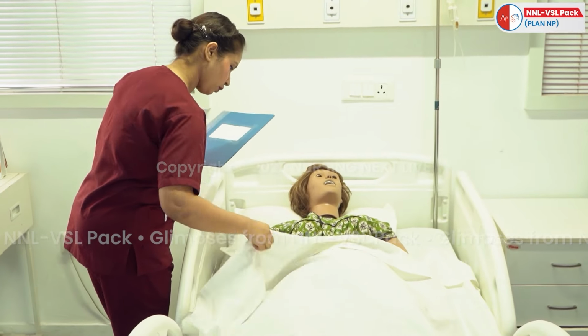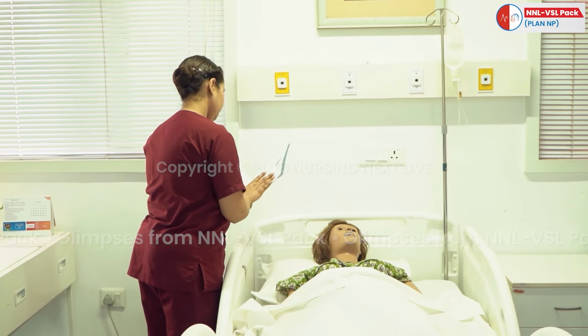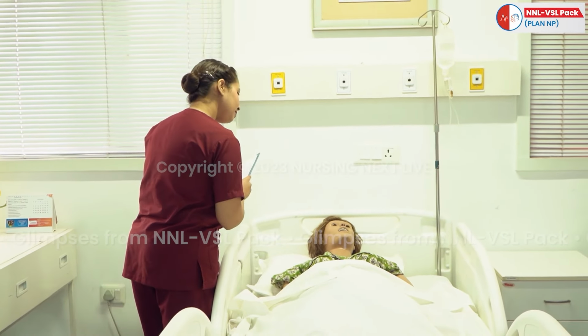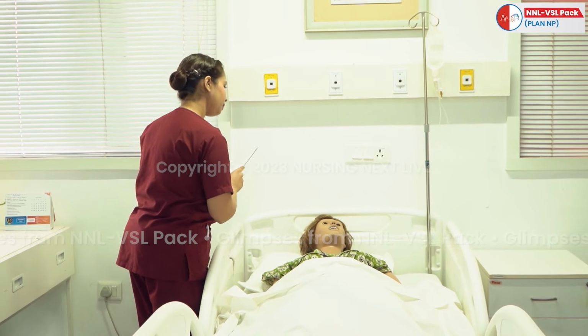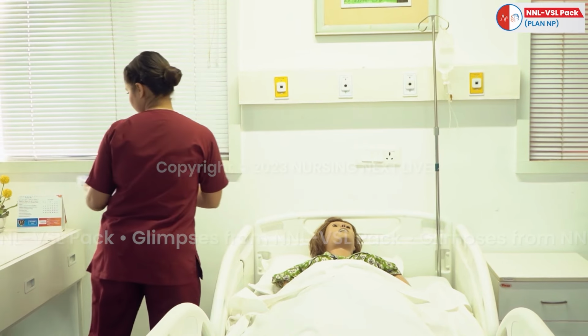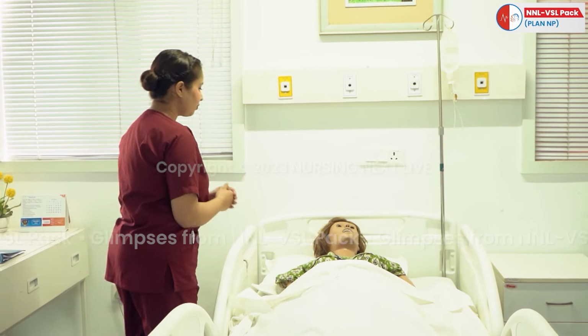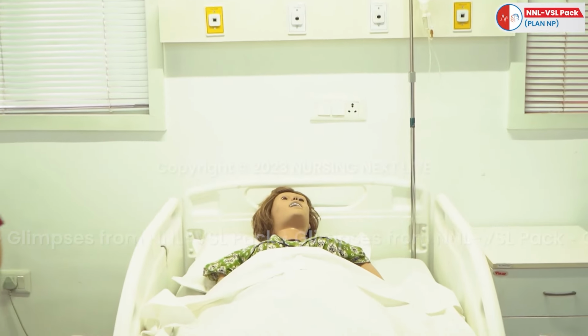Check the CAUTI bundle checklist and explain the procedure to the patient. Ma'am, as it is time for your catheter care, now I'm going to provide you a catheter care. Please cooperate with me. Arrange the articles. Just give me a moment. I will arrange my articles and I will be back. Provide privacy.